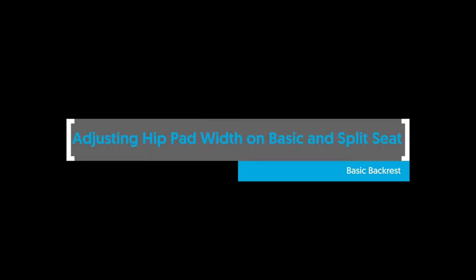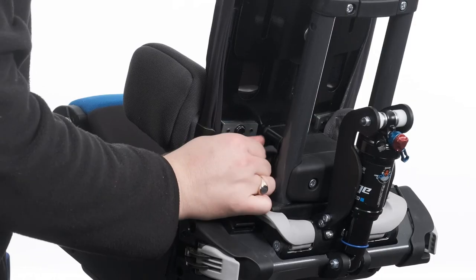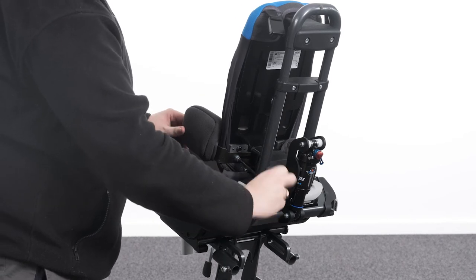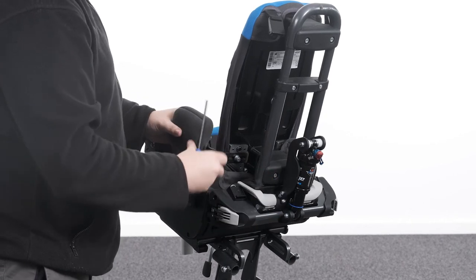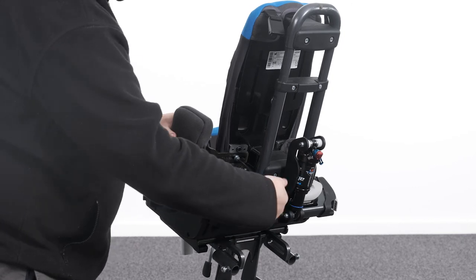Adjusting hip pad width on basic and split seat — basic backrest. To adjust the hip pad width on the basic backrest, release the snap fastener of the backrest cushion to gain access to the adjustment bolt. Loosen the bolt and adjust inward or outward to the desired position. Tighten the bolt to secure in place.